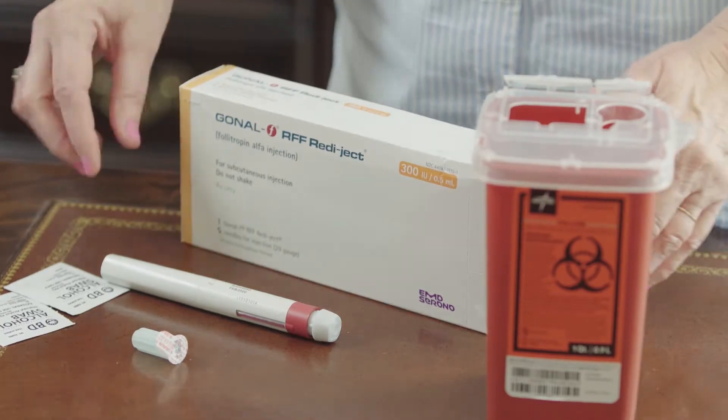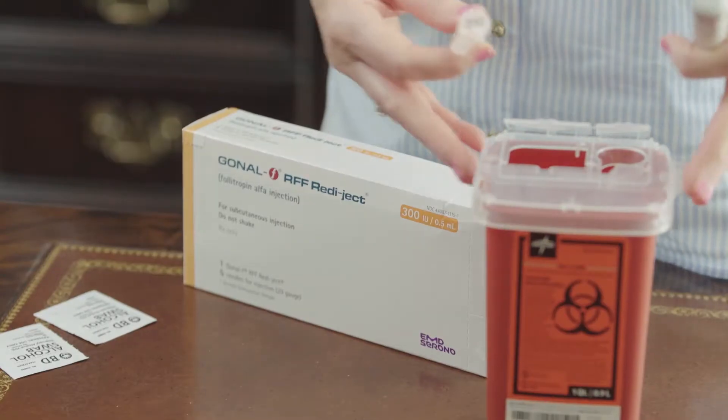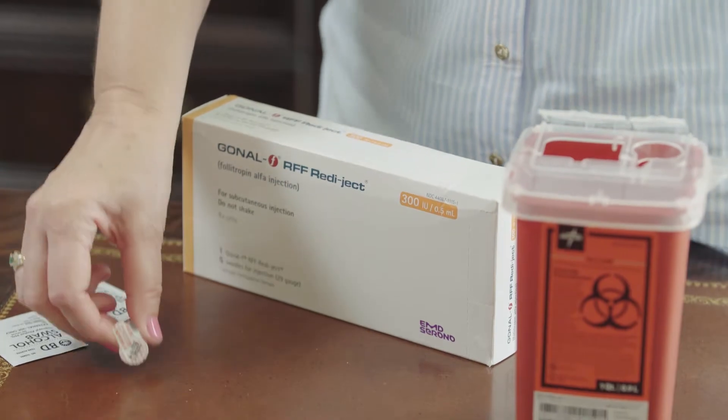The medication will be stored in the refrigerator. What you will need is the actual Gonal-F Pen device, which is preloaded with the medication. You will need alcohol swabs and your pen needle, along with your biohazard box to discard your needle into. Prior to giving your injection, you're going to want to wash your hands thoroughly and dry them.